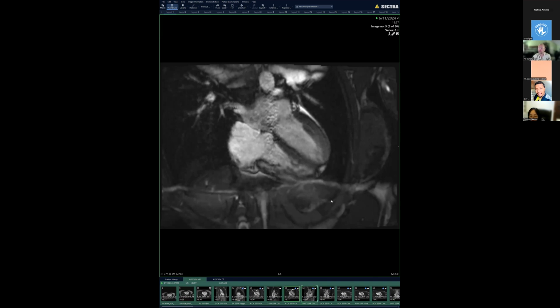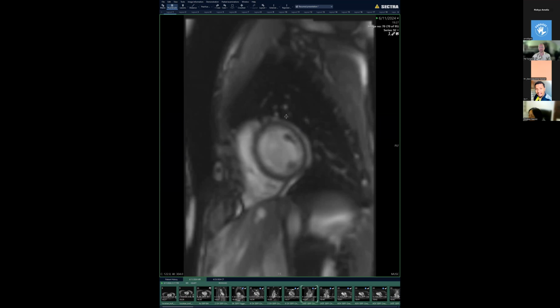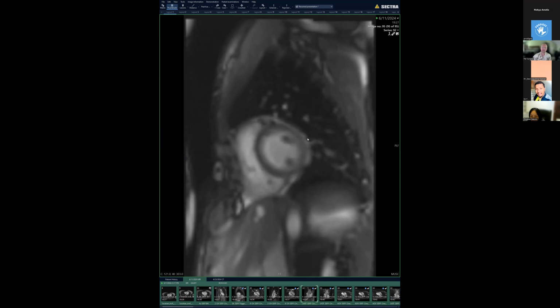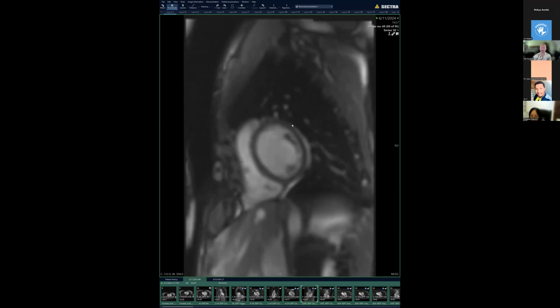So we ended up doing some real-time images to test for pericardial constriction. This is real-time imaging, so super fast images that are being reconstructed, and we can visualize them as soon as we are acquiring them. So there's no cardiac gating needed. They're just super fast images, and you get about 10 images per cardiac cycle, or 7, depending on the heart rate and your scanner speed.